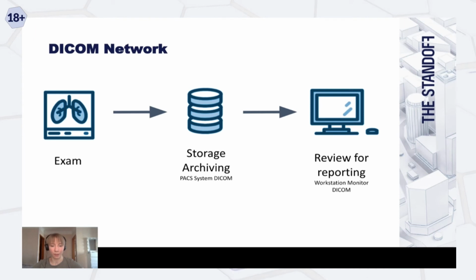Okay, we ended up with DICOM format here, and I think we'll just need to think about the protocol which describes the network. DICOM describes the interconnection between the two devices. There would be two devices: the device that does the study, does the examination, I would say, and the actual database of DICOM, or DICOM server.